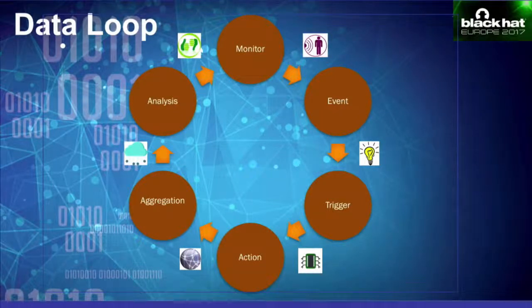After that is done, that data is aggregated, so it could be sent to a hospital's private network over VPN. It could be sent to a cloud infrastructure or simply stored on the device. This data aggregation part and the next step, data analysis, are some of the most important parts, at least they're going to be more important in the near future. The analyzed data could be consumed by security researchers, device manufacturers, medical practitioners, and general practitioners as well.